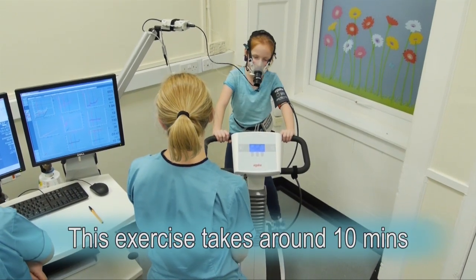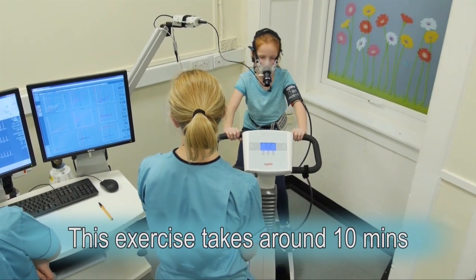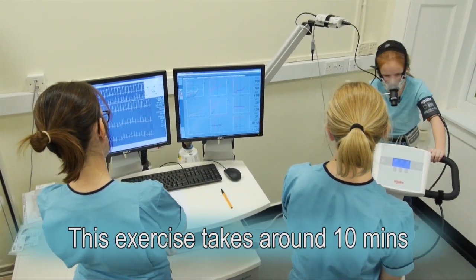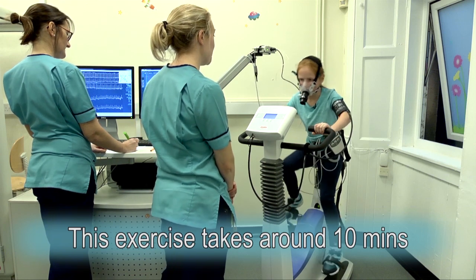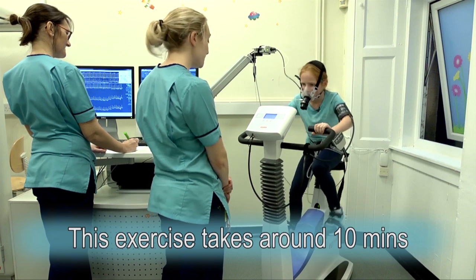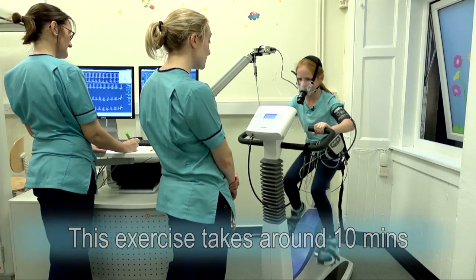Can we push that speed above 65? Keep those legs turning. Almost there now. Keep pushing. Brilliant. Legs getting tired now? You're doing really really well — just keep those going.